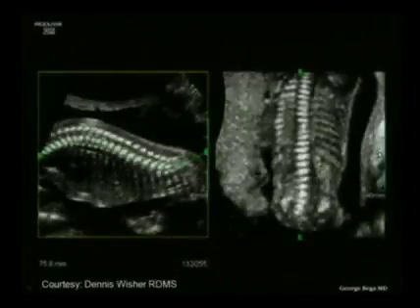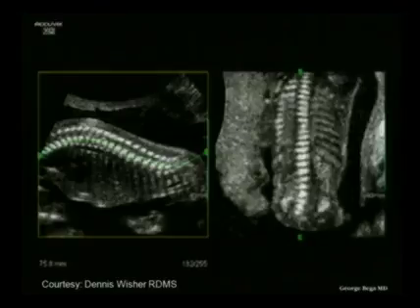Now, the displays don't have to necessarily be orthogonal and straight. Manufacturers are increasingly putting efforts to introduce tools that can adjust and conform to the curvature of the anatomy, which can be irregular shaped.